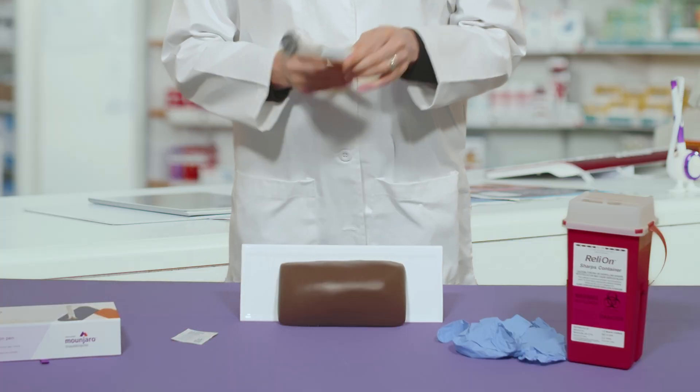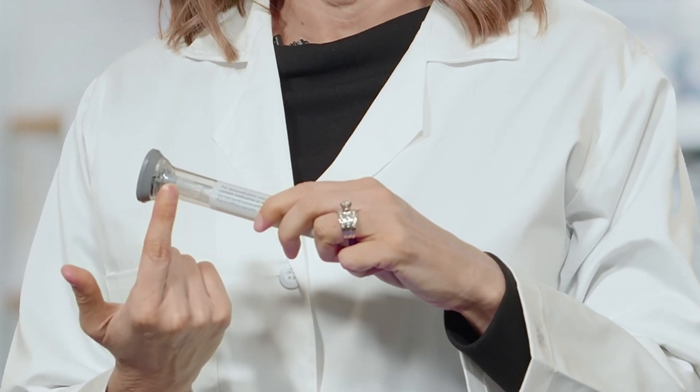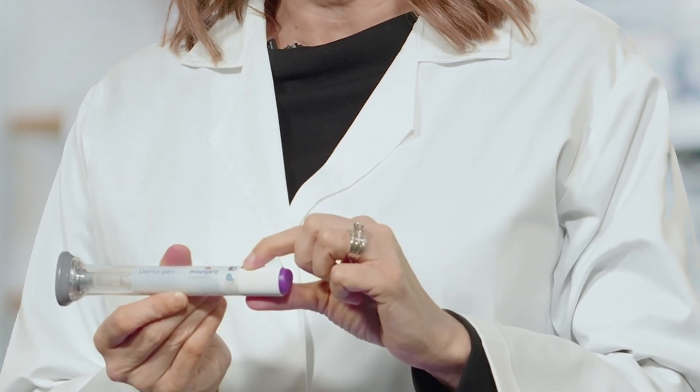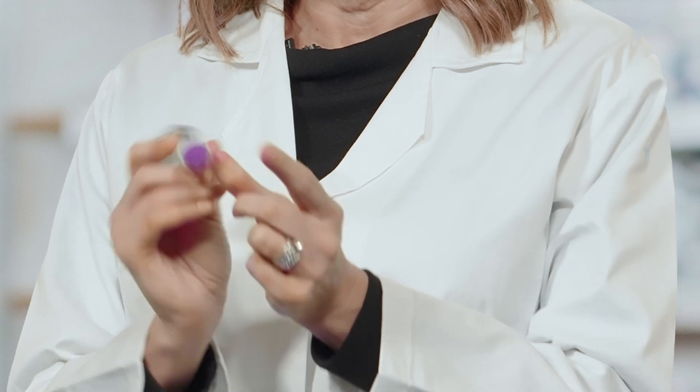It's a little bit different than an insulin pen, so I will go over this injection technique. The pen has a base cap, a clear base, a medicine window, lock and unlock icons, an indicator arrow, a lock ring, and a button.